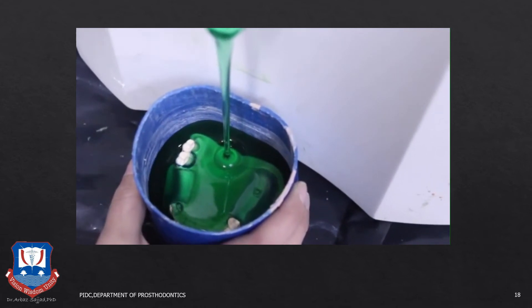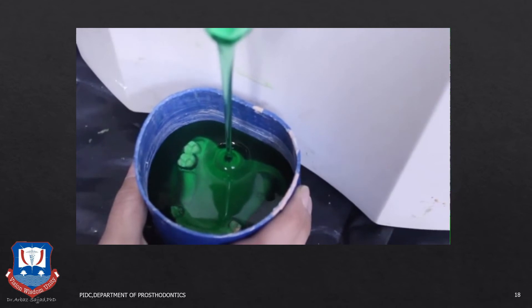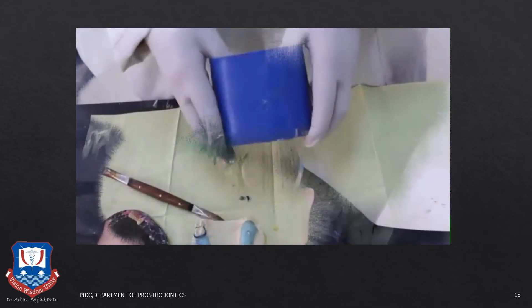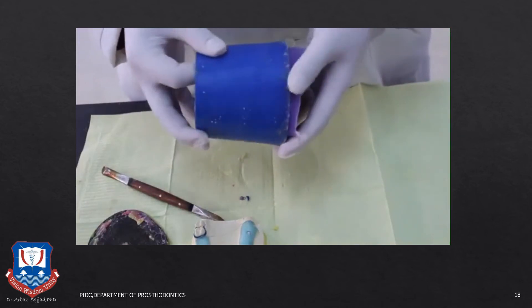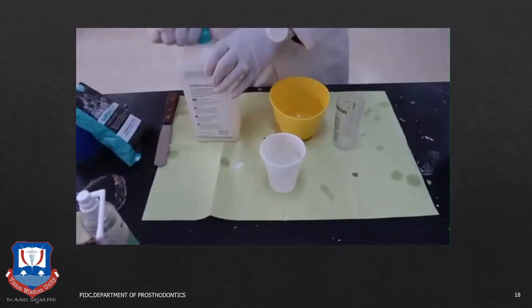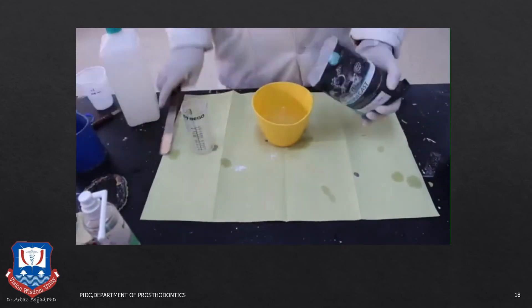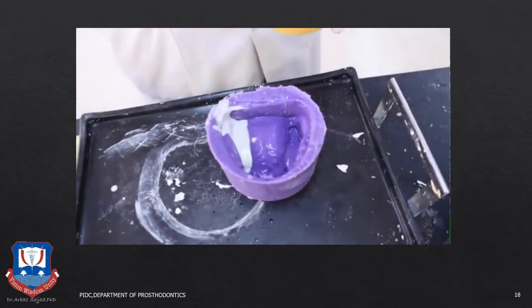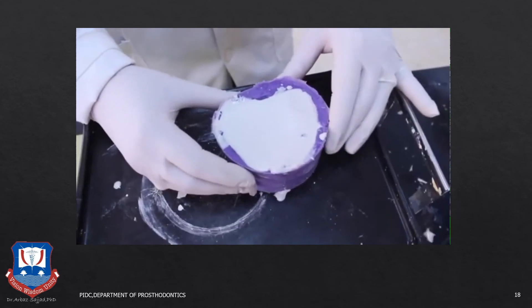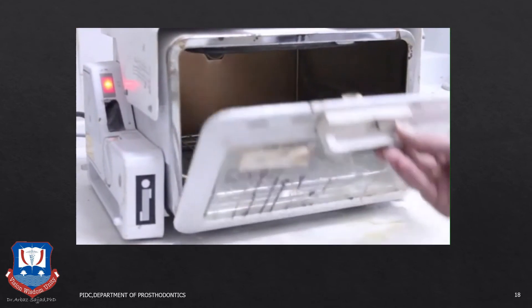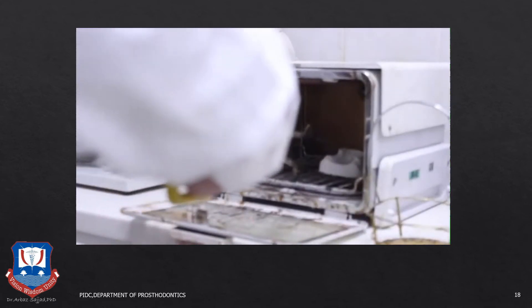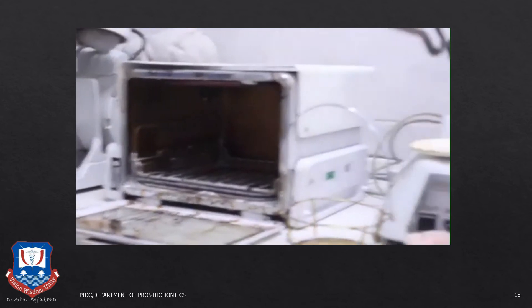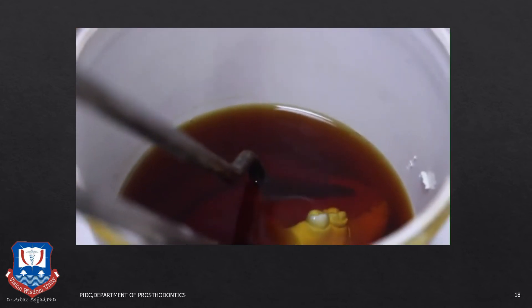Once the agar agar is melted, the mold is ready with the blocked out master cast, which is then poured with molten agar agar until the top of the mold is filled. The agar is then allowed to cool until it approaches room temperature, after which the mold is disassembled. The refractory cast is then duplicated using a refractory investment material — usually a phosphate bonded investment material is used to prepare the refractory cast. After the refractory cast is set, it is dried in an oven because it contains a lot of moisture absorbed from the agar mold.